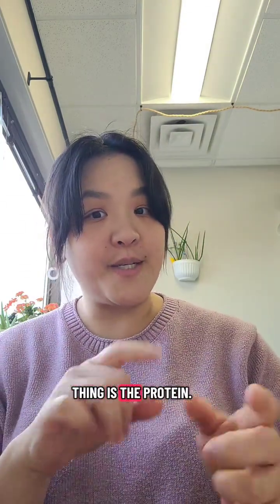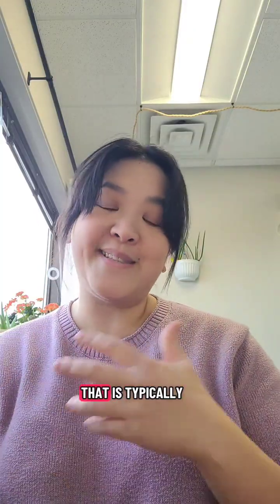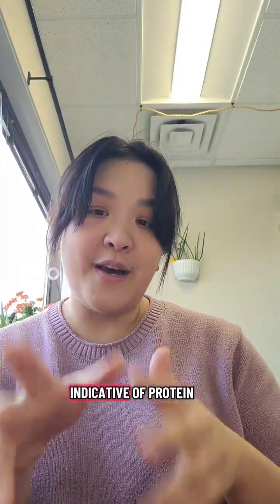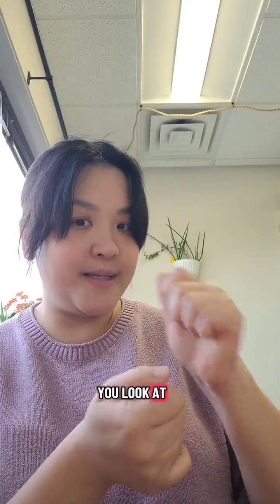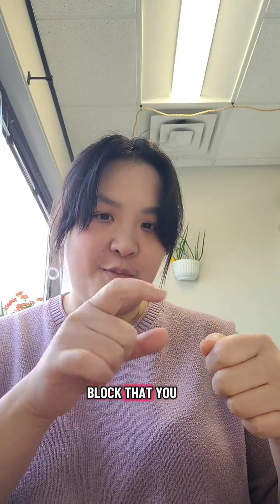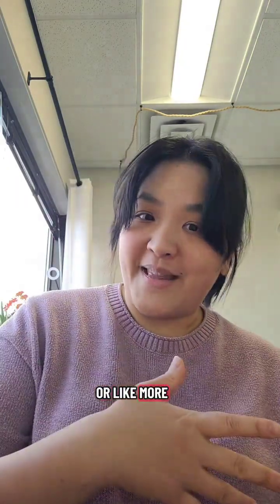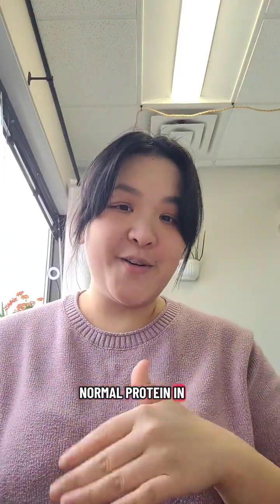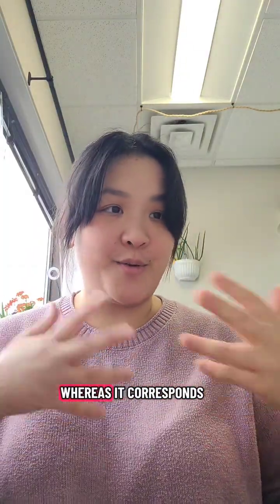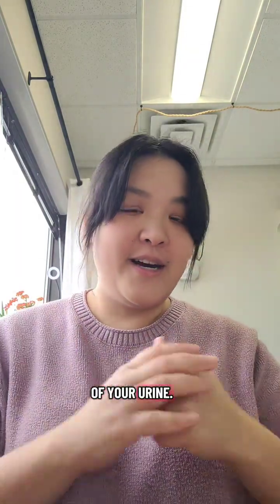So the first thing is the protein. Earlier in the physical examination, I mentioned that if there is frothy urine, that is typically indicative of protein in the urine. And generally, if you look at the dipstick analysis, it will be sort of a color on the block that you match with the canister, and then you can see if it's normal, trace, or more than that. And normal protein in urine is usually negative to trace, which corresponds to less than 150 milligrams that is coming out of your urine.